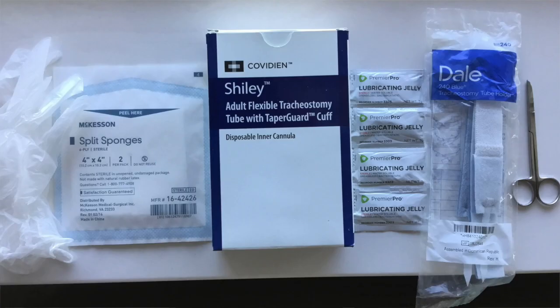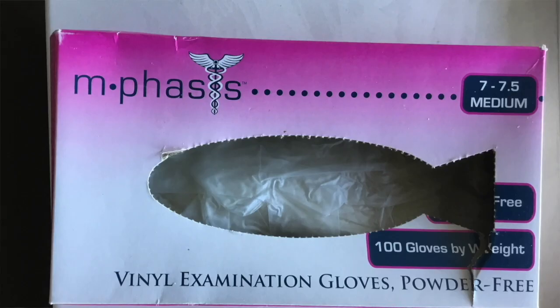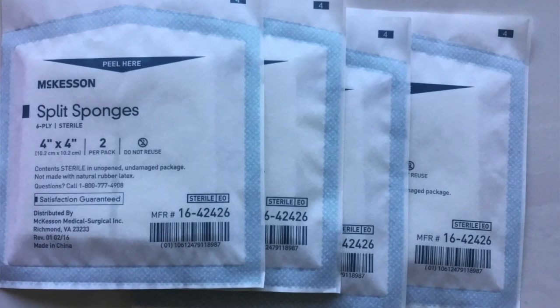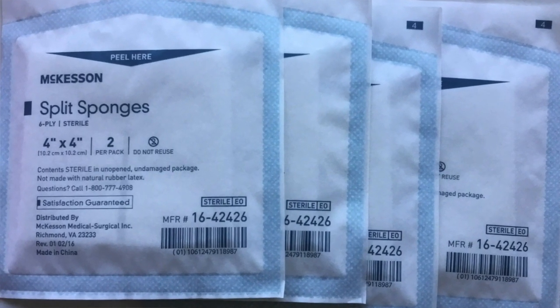When doing a tracheostomy tube exchange, it can be easy to overlook the supplies needed. Carefully review all the supplies you will use and try to organize them in order. It is also really helpful to have extra supplies available during the exchange, as you may accidentally get your gloves dirty or drop gauze on the floor. Having extra supplies will make the procedure much easier.